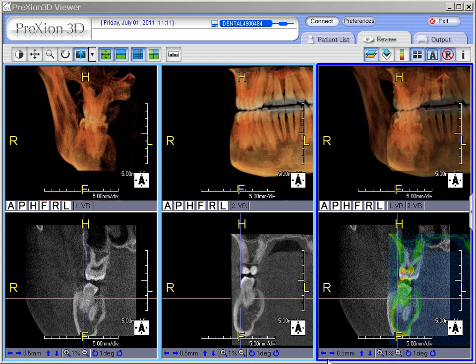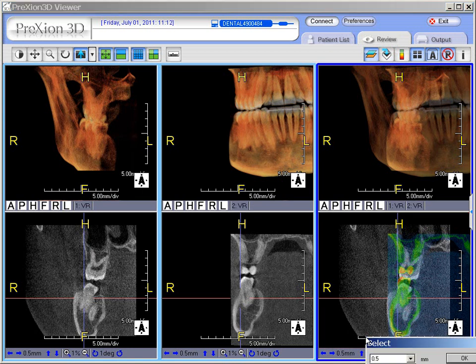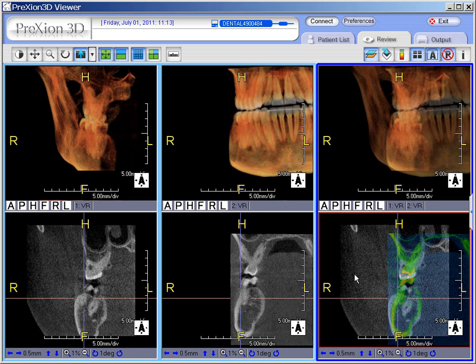At the bottom of the screen, the blue arrow indicators allow movement in one-degree increments if one wishes. The up and down arrows can be moved up and down or left and right, as well as providing a magnification factor by 1% up or down. This number can be changed if one wishes to use an integer that's not 0.5 — you can customize whatever integer you wish, or select a different one to move the arrows according to that numerical value. The images can always be sliced using the middle wheel of the trackball, so one can slice freely any section along the length of the dentition.